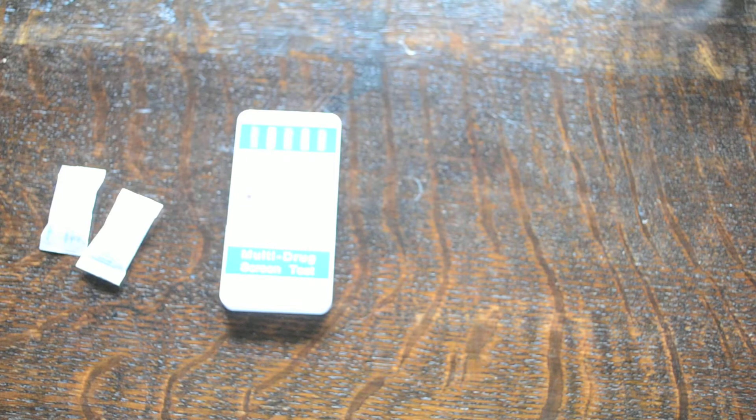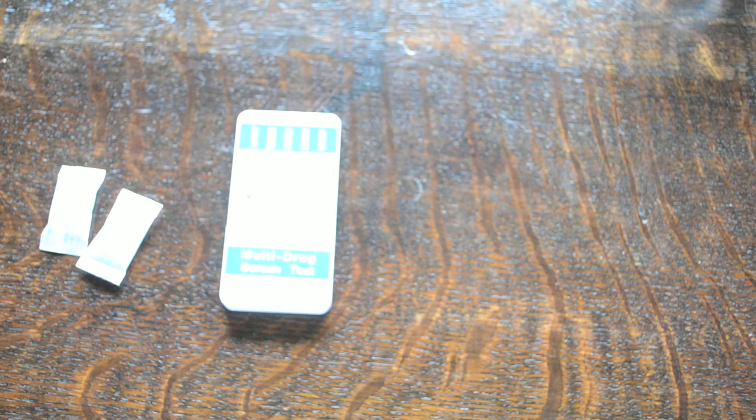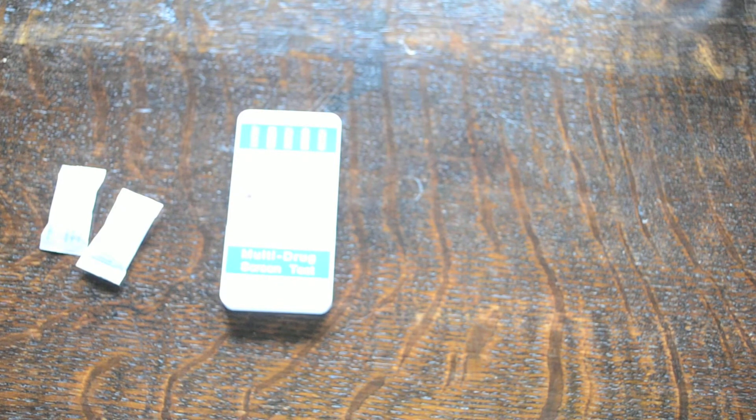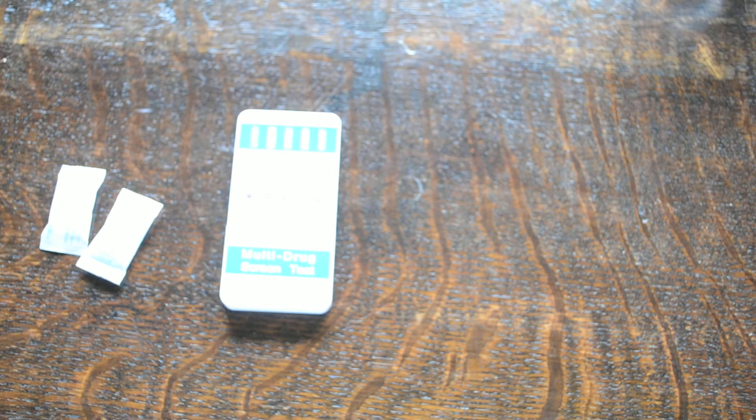That's the seven-in-one panel test. This one we showed you is in CoreTest branding, also available in UK Drug Testing branding on that format. Different combinations are available of the seven panel from our website, ukdrugtesting.co.uk.